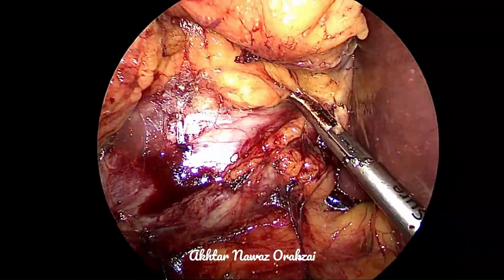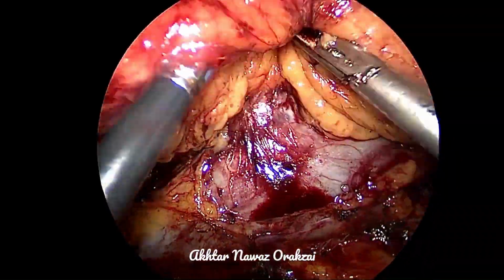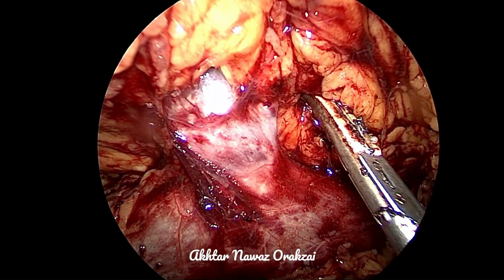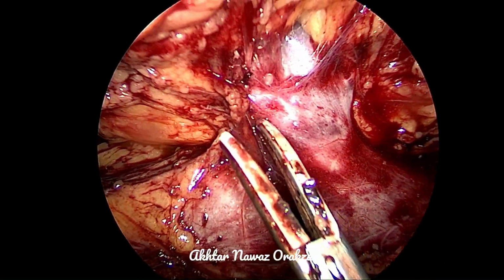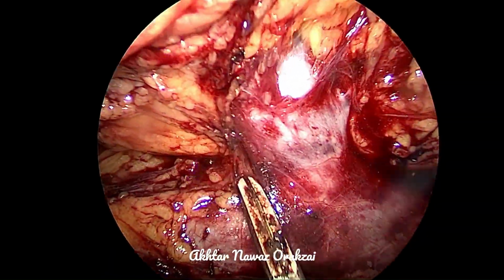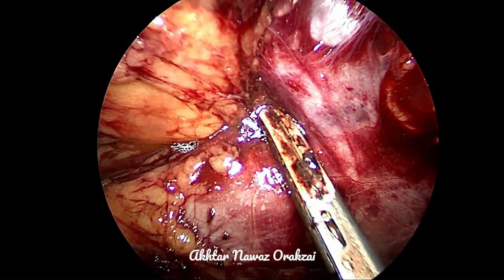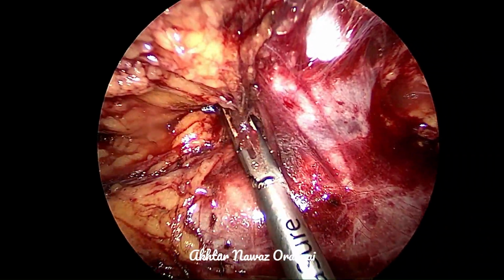So from the knowledge of the CT scan, we know that the artery is lying posterior superior to the vein. Here you see a very small venule. The slightest of pressure can lead to tearing, and it looks very small, but when it starts bleeding, it's horrible. So the inferior angle of the vein does not have any pulsations, which confirms the findings of the CT.